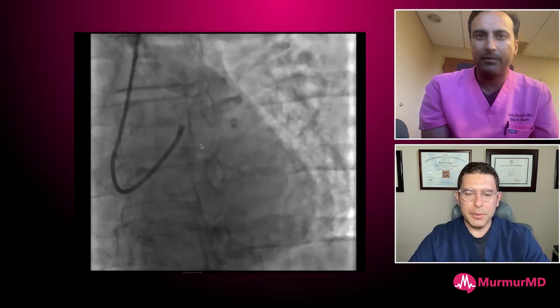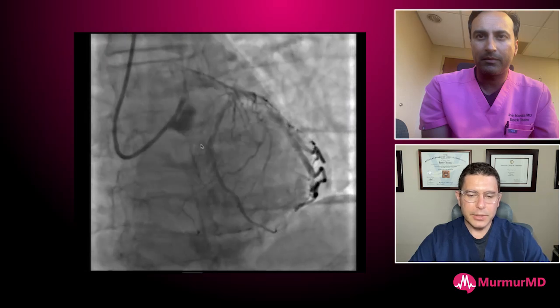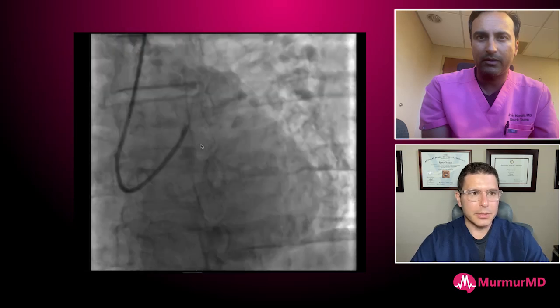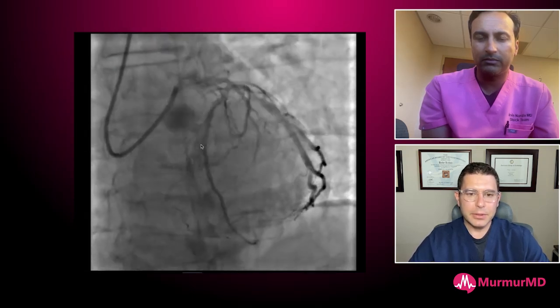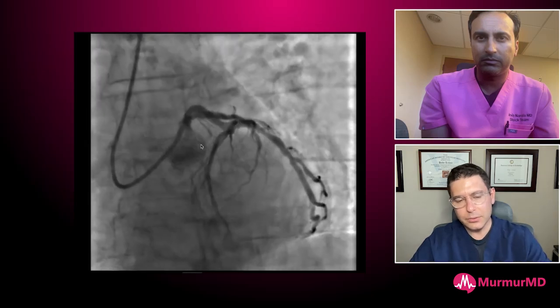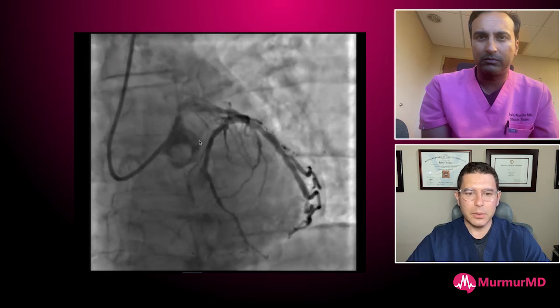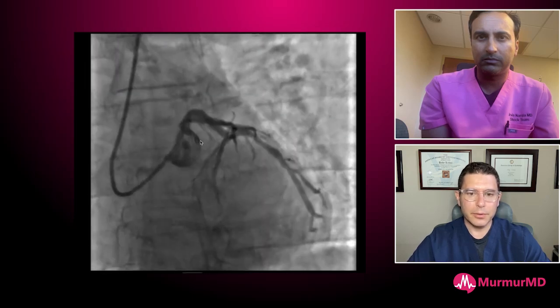This is a middle-aged gentleman without known coronary disease, a smoker, who presented with an inferior STEMI — typical presentation. In my practice I like to look at the left main before I start working on the right if this is a right coronary culprit.